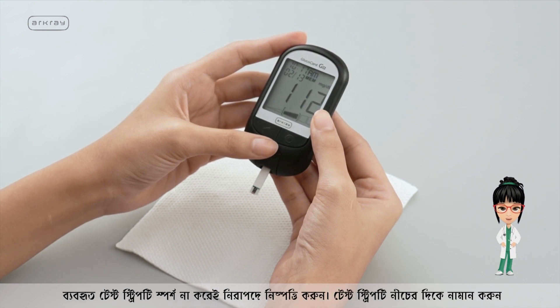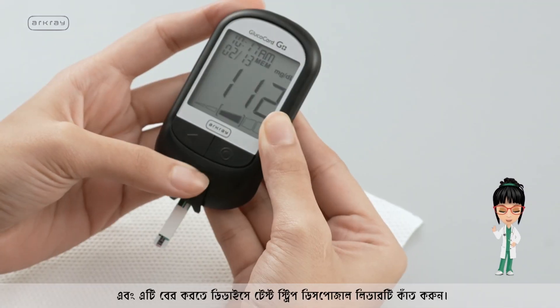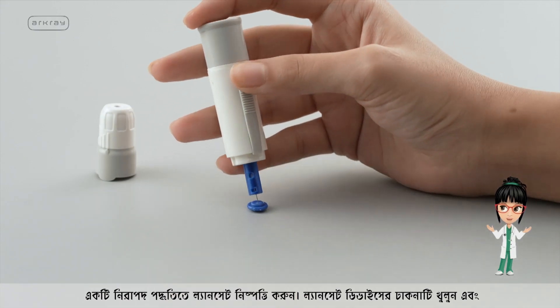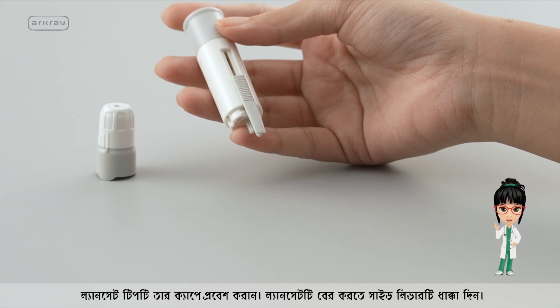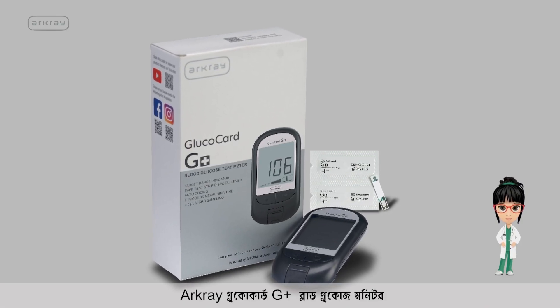Dispose of the used test strip safely without touching it. Point the test strip down and slide the test strip disposal lever on the device to eject it. Open the lancing device lid and insert the lancet tip into its cap, then push the side lever to eject the lancet. R-Cray Glucocard G Plus Blood Glucose Meter.